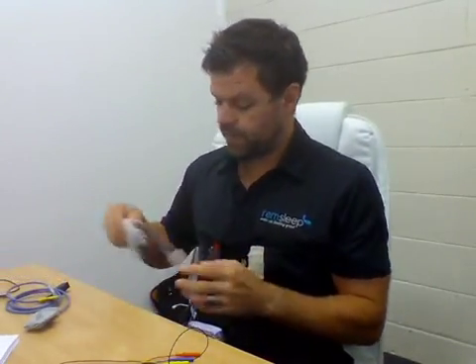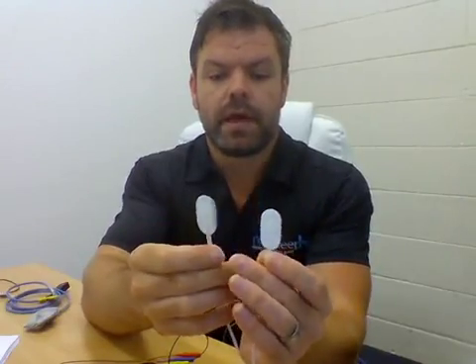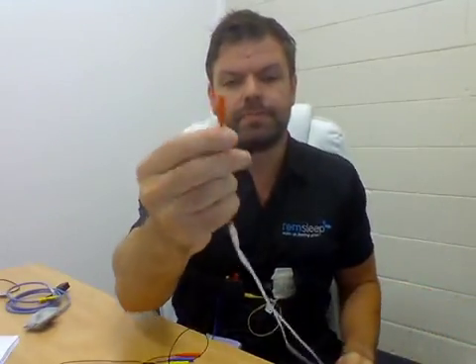The next step is step 5, which is the leg electrodes that look like this. They have two paddles. One has an R on it and one has an L, and that stands for left and right. And the leg electrodes come up to one cable, so they join up.